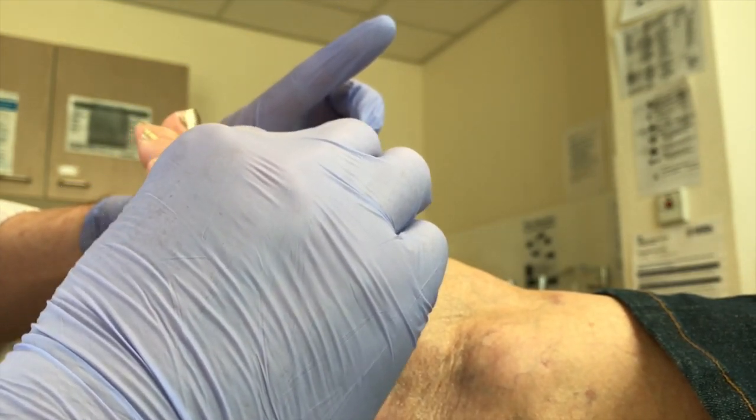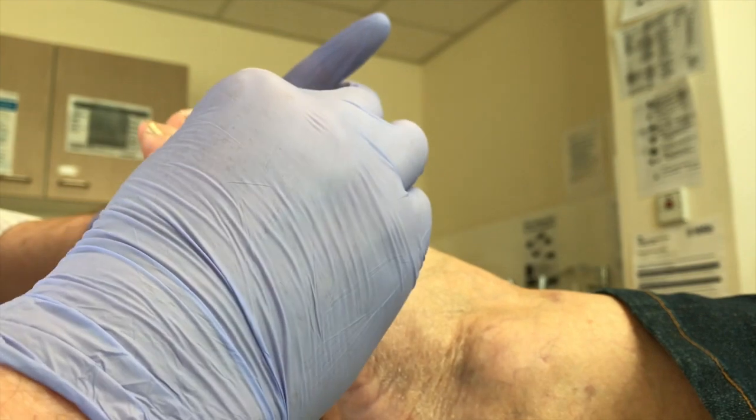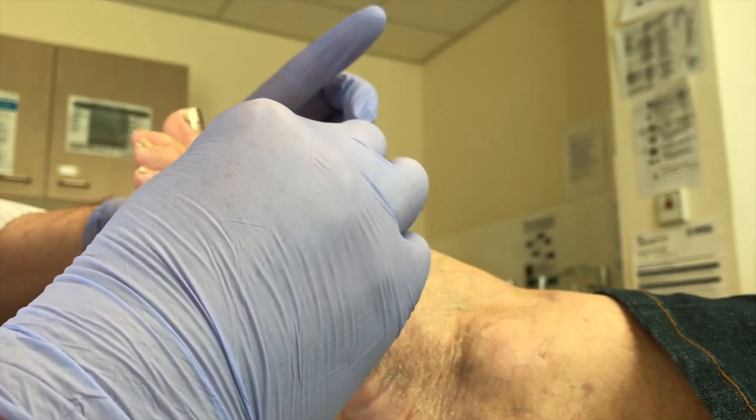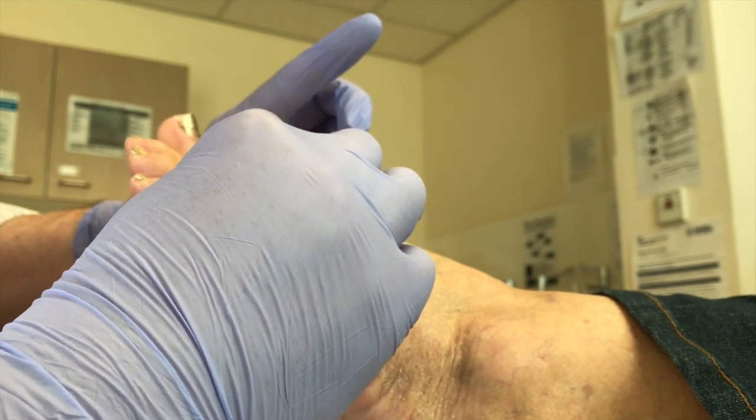Diane, how are you doing? Yeah, fine. My lady's pulling her face a little bit, and she's doing okay. So we'll put a plaster on that and that will do it. Alright, that's all done.